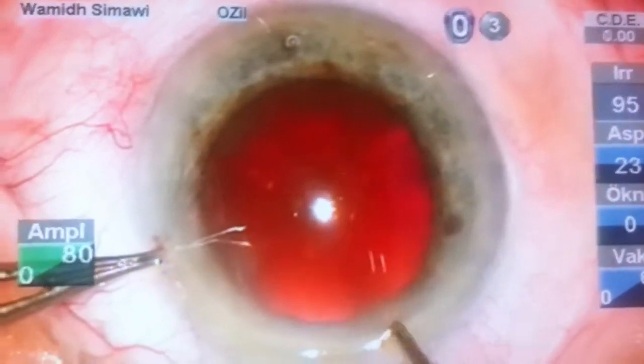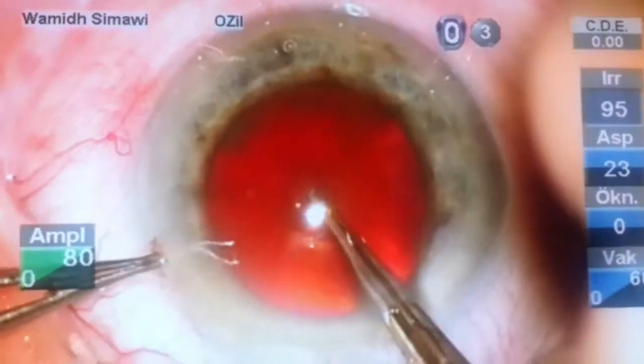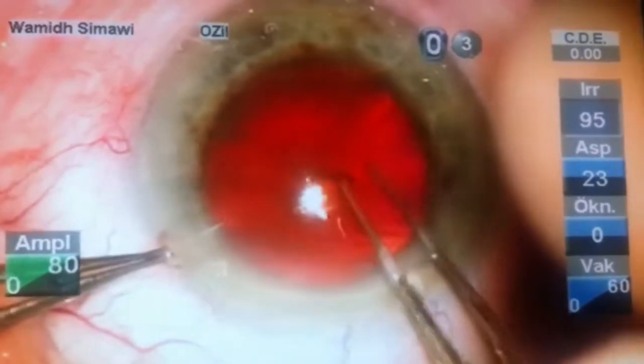This is Dr. Simavi from Stockholm, Sweden. I'm trying to share with you some ideas about how to deal with the hard nucleus.